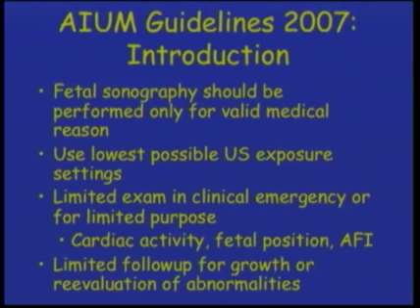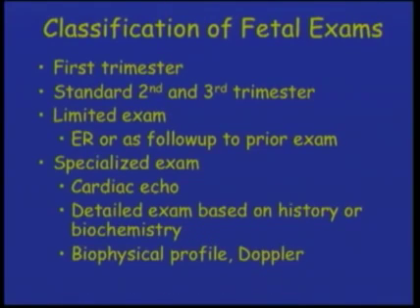Now, the introduction to the guidelines states that fetal sonography should be performed only for valid medical reasons, that we should use the lowest possible ultrasound exposure settings, and that there will be limited exams in clinical emergencies or for limited purposes, like just to check for cardiac activity or fetal position or amniotic fluid index. We can do a limited exam for follow-up after there's been a primary exam, when we're looking to evaluate for growth or reevaluations of specific abnormalities.